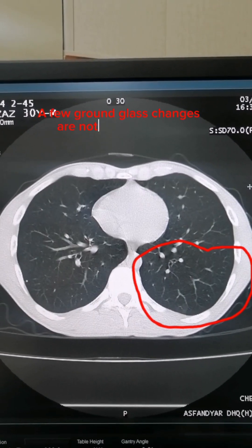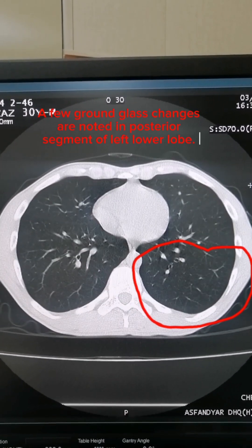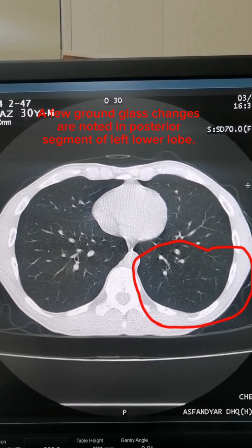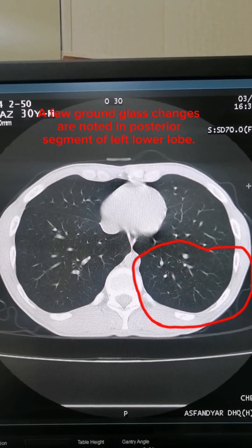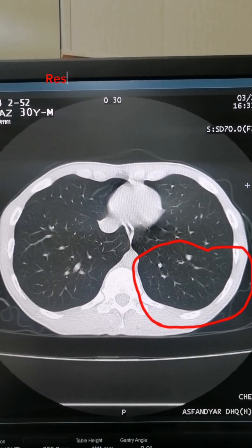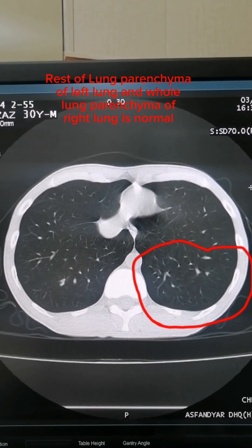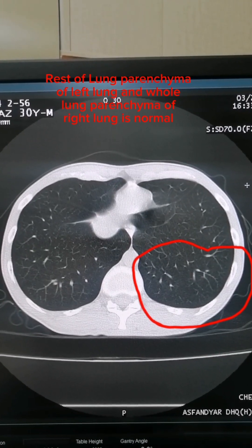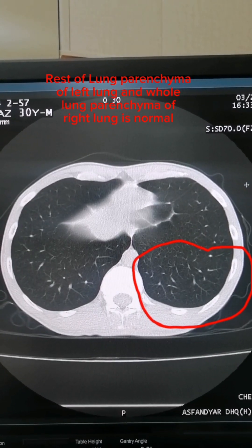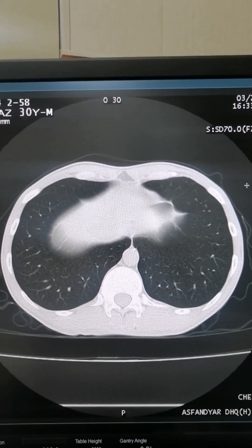A few ground glass changes are noted in the posterior segment of the left lower lobe. The rest of the lung parenchyma of the left lung and the whole lung parenchyma of the right lung is normal.